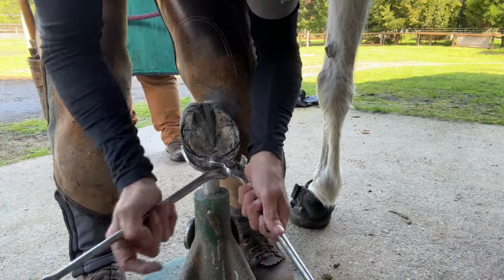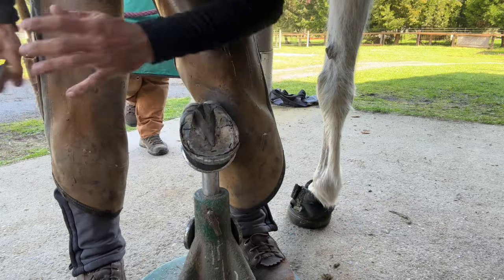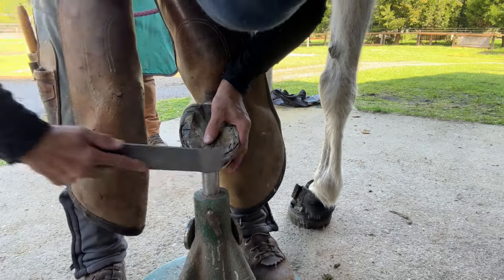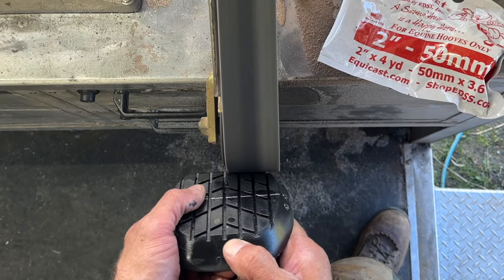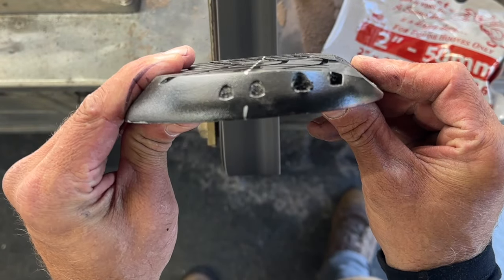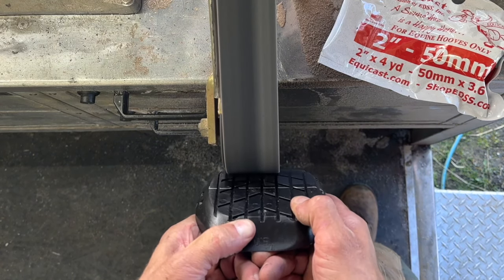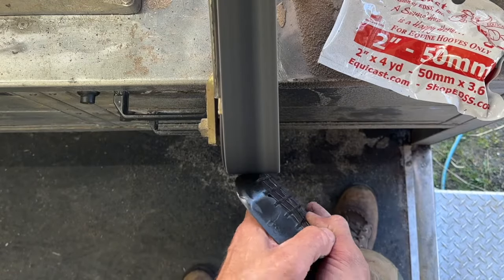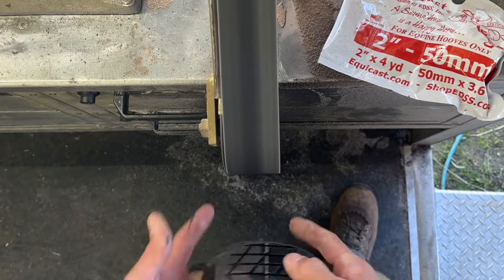Being that the frog stretched and the x-ray said absolutely, that's the part that gives me some confidence. The gray line on this clog represents the widest part of the foot and also the center of rotation. What I'm doing is creating the mechanics of a wedge, but not creating a wedge. I'm also going to remove quite a bit of material from the sides as well as accentuate the breakover on the clog, so that when I'm finished casting, I won't have added extra material. I'll still have the desired mechanics.